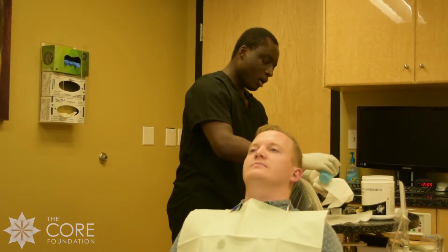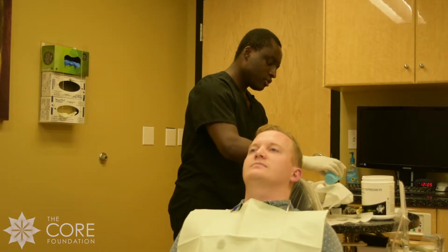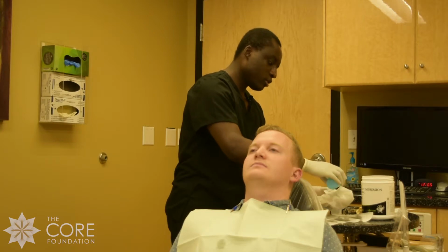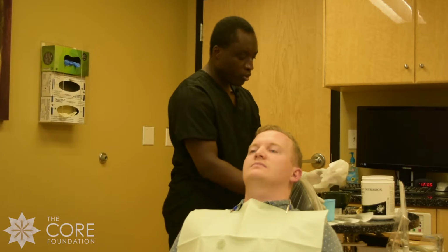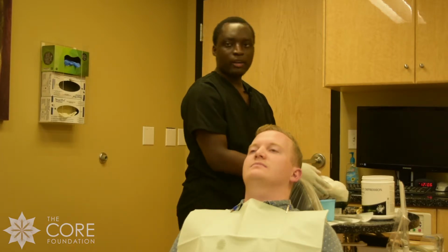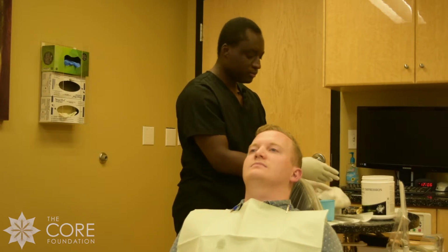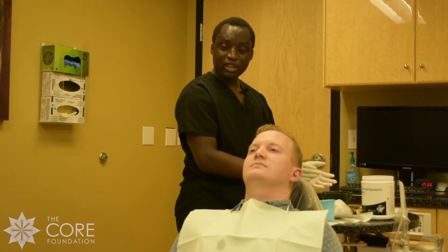And then I'll pour some of the water over it just to make sure I keep it damp and also keep the impression from shrinking until it's being poured up. Now, when you wrap the water around it, you have about 30 minutes to pour it up before your impression starts shrinking.